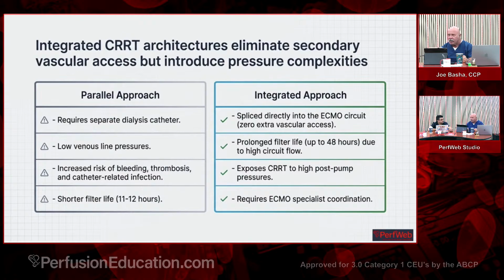Never, ever, ever allow anyone to touch the negative side of your circuit. No matter how much they want to help by connecting this CRRT return line into your line that's going into the negative side, don't let anybody ever help you.